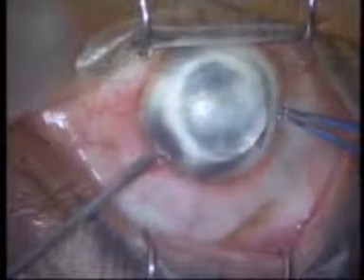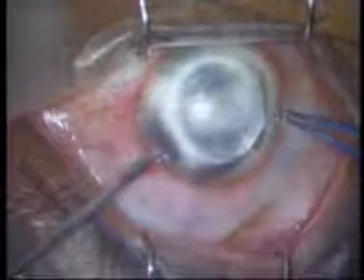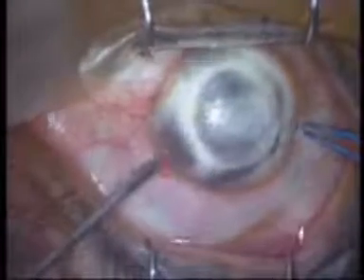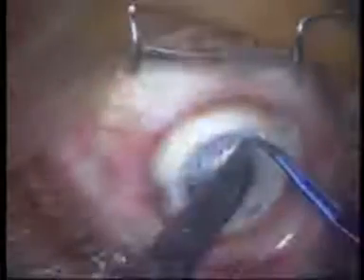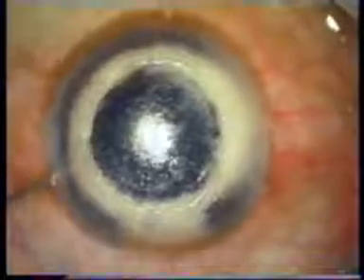At this stage, it is vital to make a paracentesis at a site peripheral to the bubble to decompress the anterior chamber and reduce the chance of Descemet's rupture during dissection. A partial thickness anterior keratectomy is then performed, leaving a layer of corneal stroma anterior to the air bubble. After the keratectomy is completed, some intraocular fluid is drained through the paracentesis.